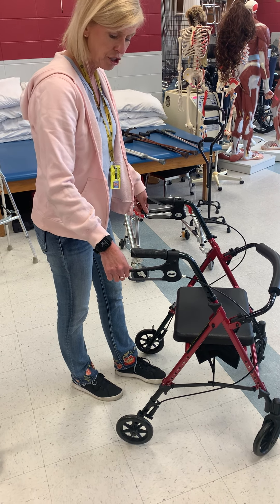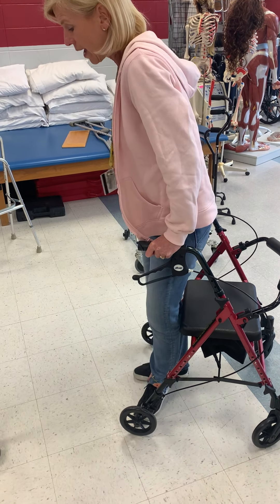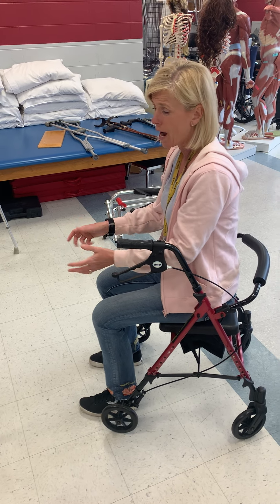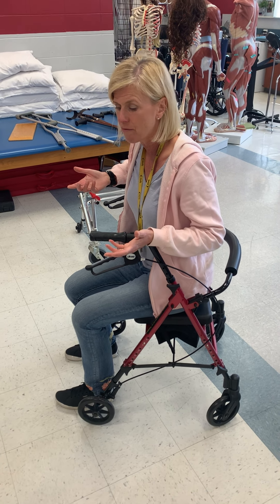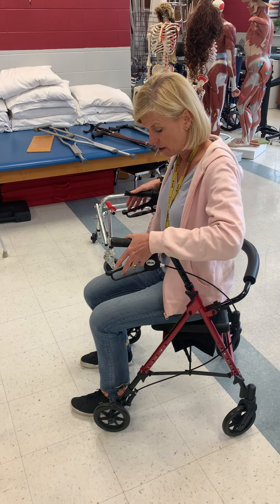When you lock these rollators, you've got to push down. Then the patient can turn around and sit. So if they're at the dryer and want to fold clothes, they can do it in a sitting position. Or if they get tired — say they've walked 25 feet and they're short of breath — they can turn around, sit, and relax for a period of time.